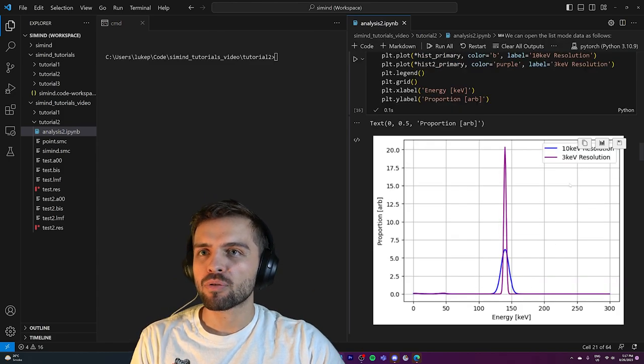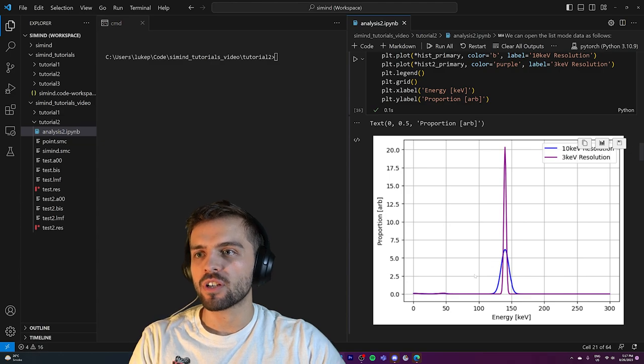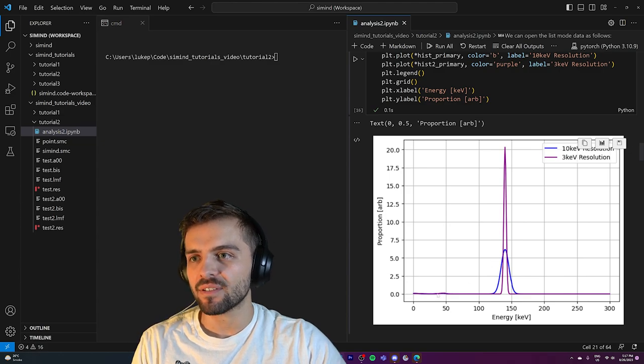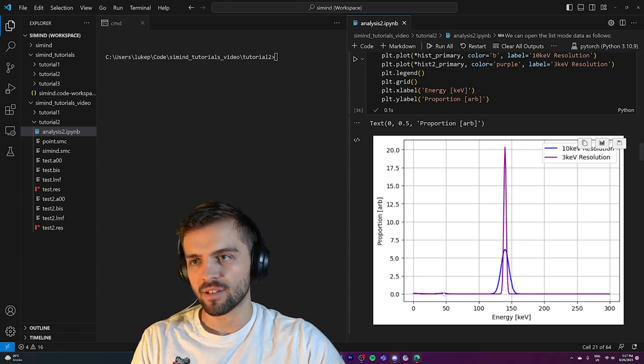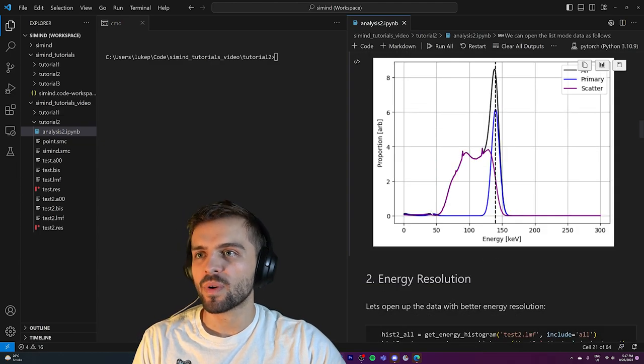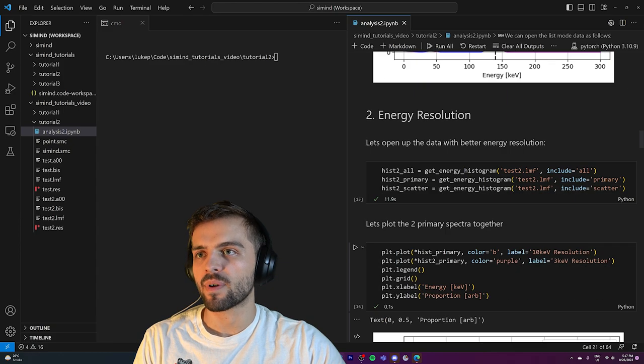You can see that the 3% resolution gives a much narrower spike in energies, whereas the 10% one is a little bit wider. What it means is that energies detected are more precise with better detector resolution. But with primary photons, you still get a slight bump at lower energies. The question is: where does this bump come from?